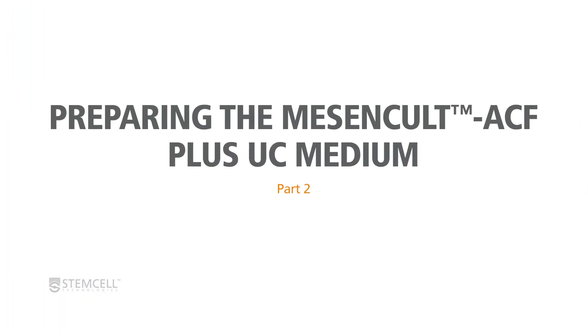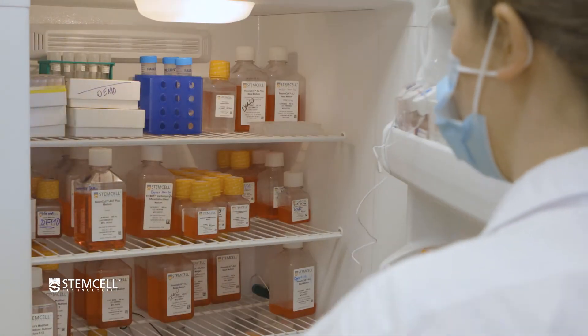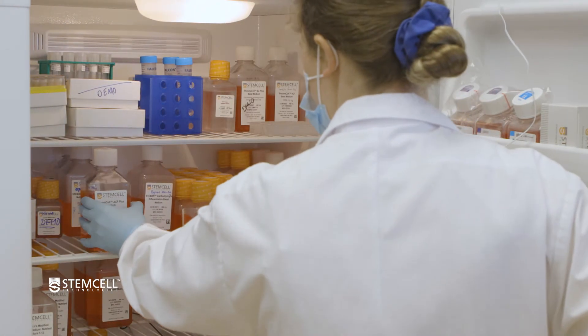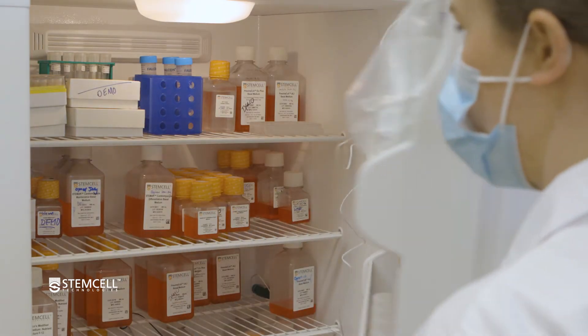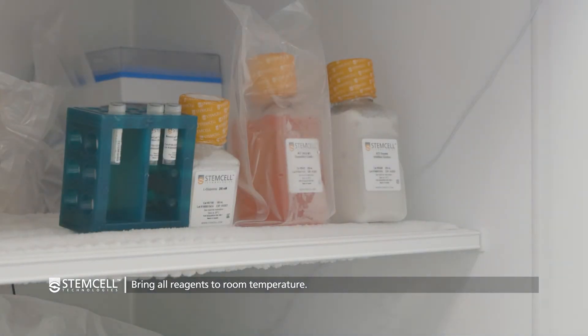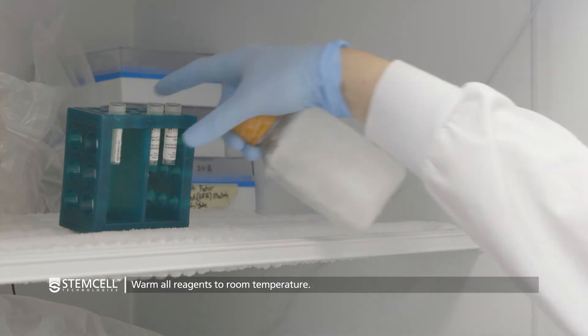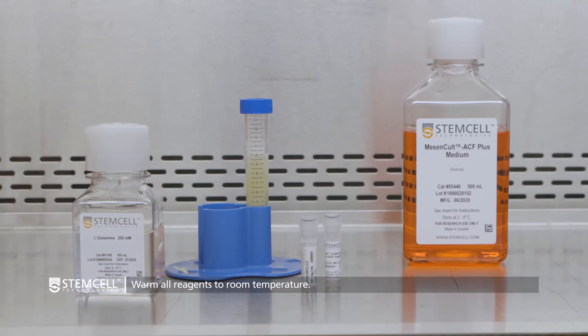Next, prepare the complete MesenCult ACF Plus Umbilical Cord Medium. Before you begin, remove the bottle of MesenCult ACF Plus Medium from the refrigerator and place it on the bench top to bring to room temperature. Remove the vials of MesenCult Umbilical Cord Derivation 500X Supplement, L-Glutamine, and Gentamicin from the freezer and leave them to thaw at room temperature.